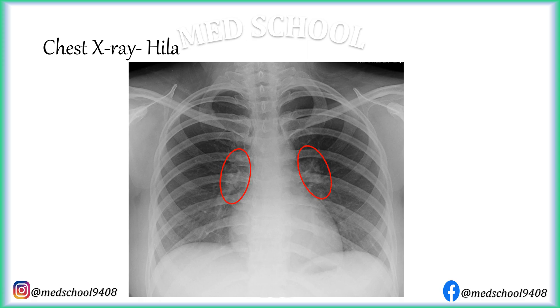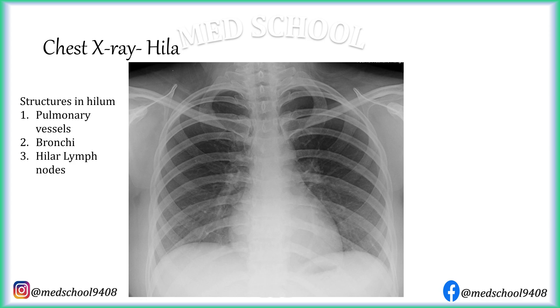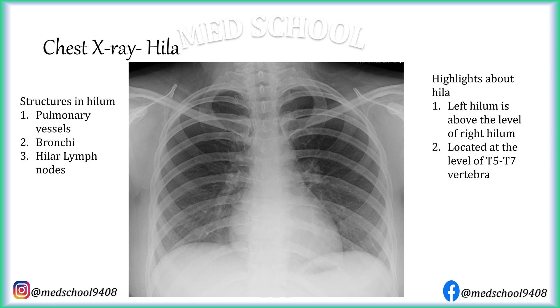Hila are radiopaque structures between the lungs and mediastinum. Structures in each hilum are pulmonary vessels, bronchi, and hilar lymph nodes. Normally the left hilum is slightly above the level of the right hilum, but both are present at the level between the 5th to 7th thoracic vertebra. Hila can become more prominent in perihilar pneumonia or hilar lymphadenopathy. The prominent structure in the right hilum is the right interlobar pulmonary artery, and the stump-like structure in the left hilum is the left pulmonary artery. Both structures can be enlarged in pulmonary artery hypertension and pulmonary embolism.